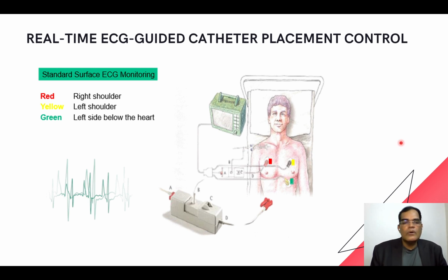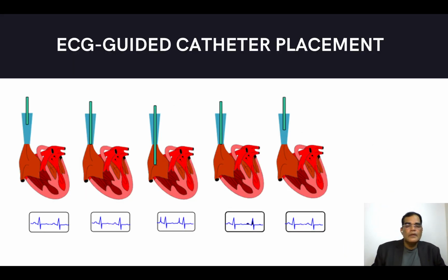So why this slide is over here is, once we place the catheter, we need to make sure that the catheter tip is in the right place. Otherwise, the patient may get a little bit of arrhythmia, or a discomfort, or a kind of sucking feeling, or they feel a little bit uncomfortable or a vibrating catheter during the dialysis especially. So these are the relative guidelines.